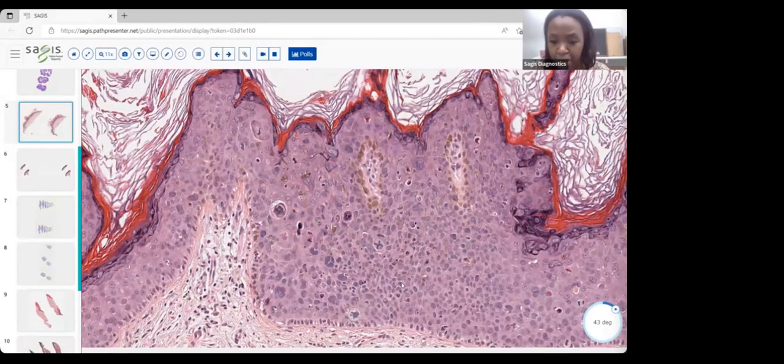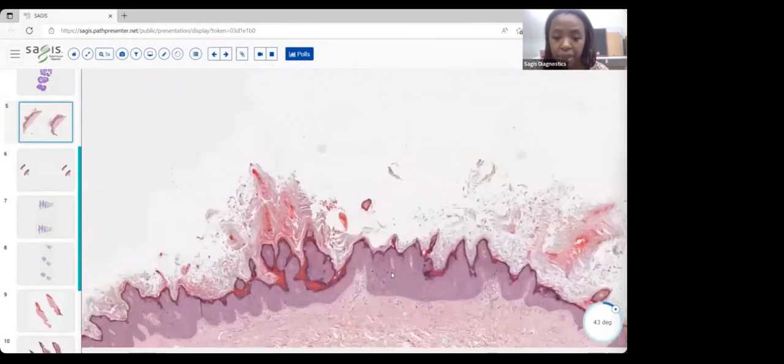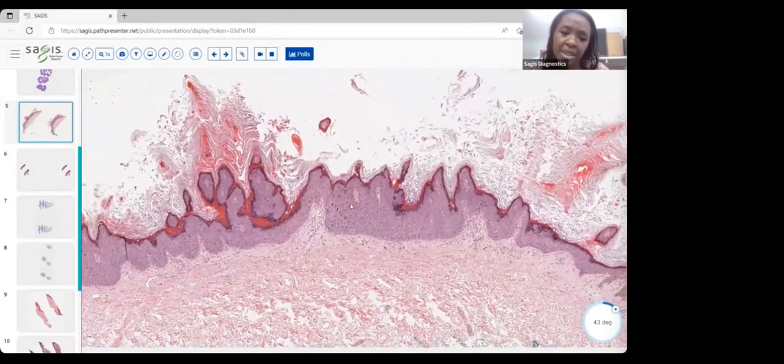These cells are very pleomorphic. One does not look like the next, does not look like the next. This is very atypical, right? A lot of atypia here. Okay, so we have a lesion with this kind of warty architecture, but there is quite a bit of atypia here. So we're starting to think about, could this be squamous cell carcinoma in situ, also known as Bowen's disease, right? But with the architecture, it just makes us think, and it's not really full thickness, it's Bowenoid.